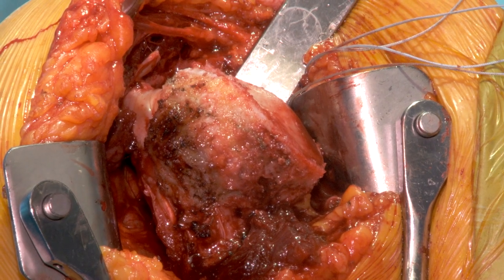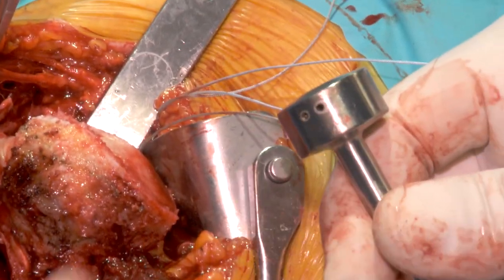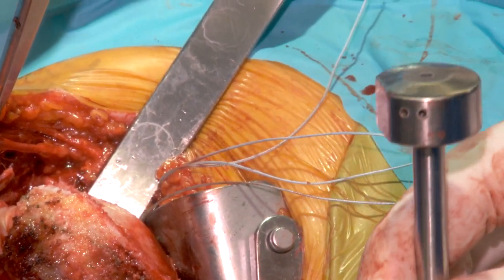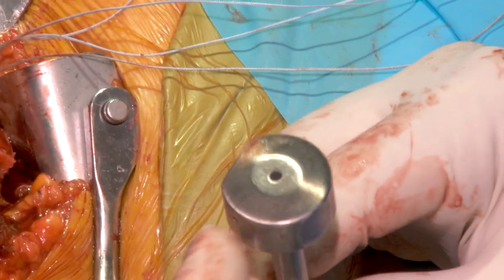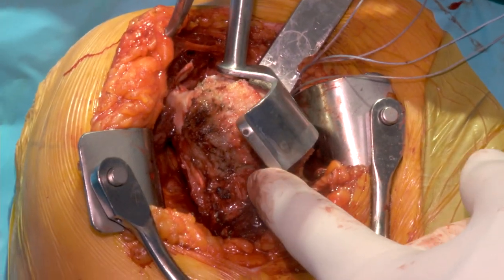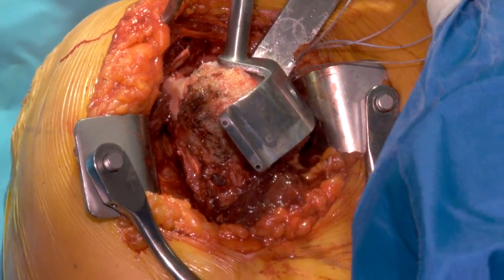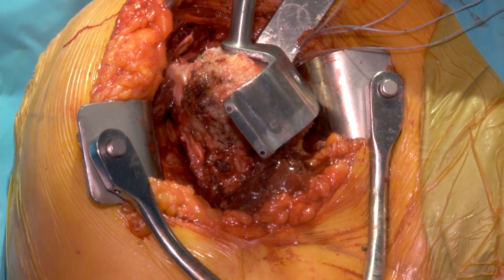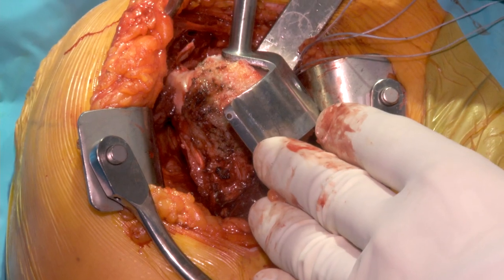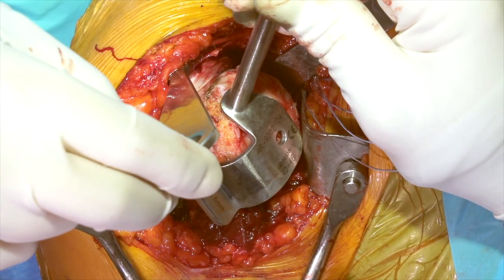This guide also has a couple of holes to put in some outriggers or pins, which will help us with our version. We have one at 20 degrees and another at 40 degrees, and the humerus will sit in between that. We can analyze that by looking at our pins and see where they're coming out with the humerus to identify that we're in a good position. This is an intramedullary base guide; there's also an extramedullary base guide.